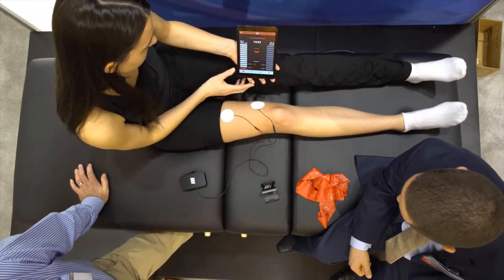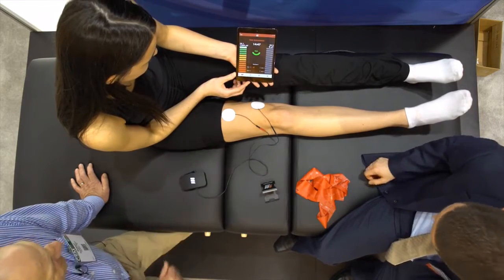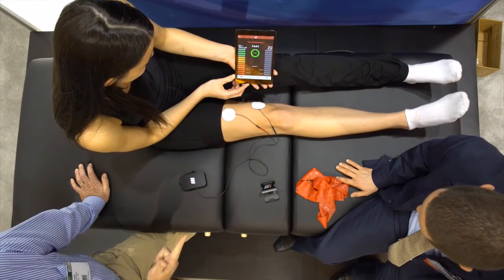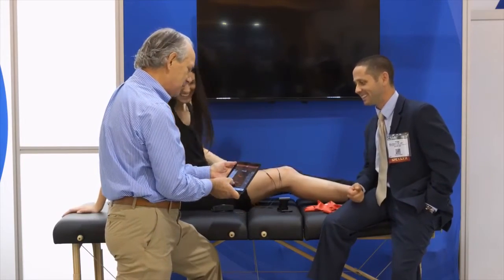Squeeze hard now — force the back of your knee straight and keep that light full, keep it full all the way, pull hard. It helps with quad re-education, and in this case it helps with extension as well. She just had 20 degrees of flexion contracture at the bottom, exactly.